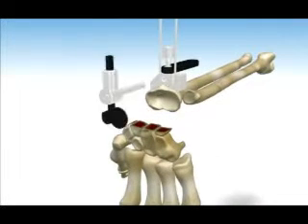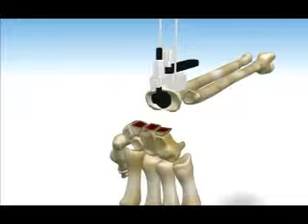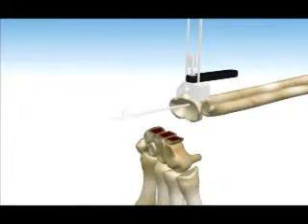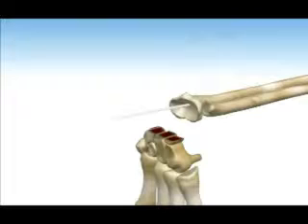Insert the PGT radial pilot template into the PGT guide. The radial pilot template should sit firmly against the prepared surface of the distal radius. The radial pilot template may be adjusted dorsal and palmarly to achieve correct dorsal palmar alignment. Place the 2 mm guide pin into the radius. Remove the template. Confirm the position of the guide pin with biplanar X-rays.